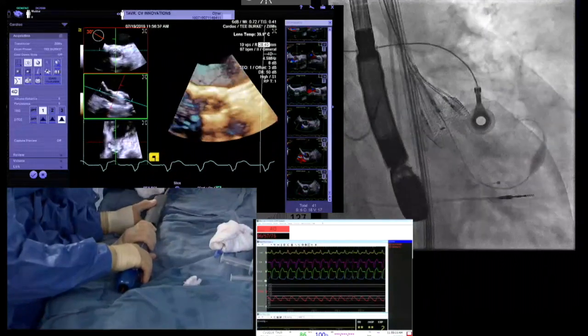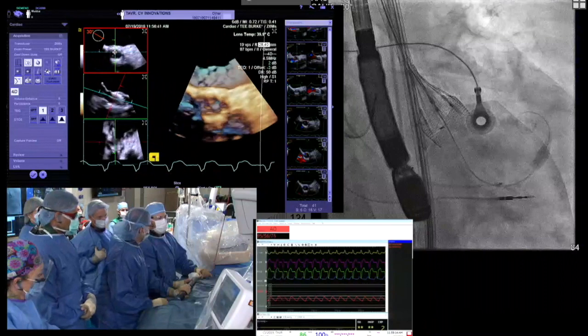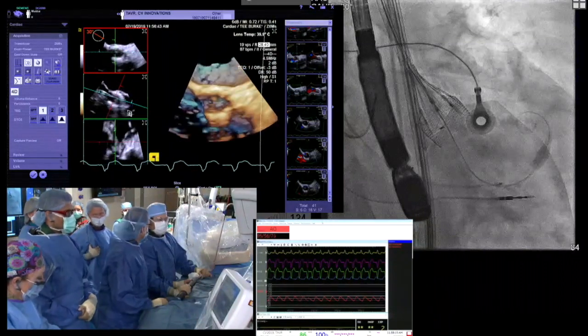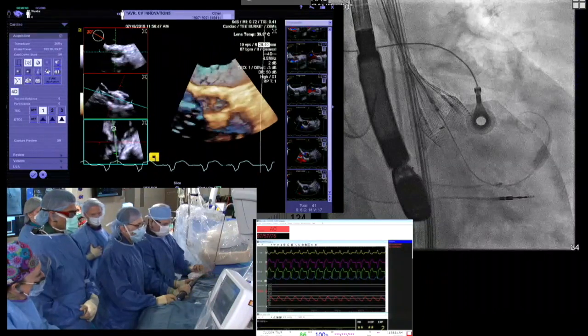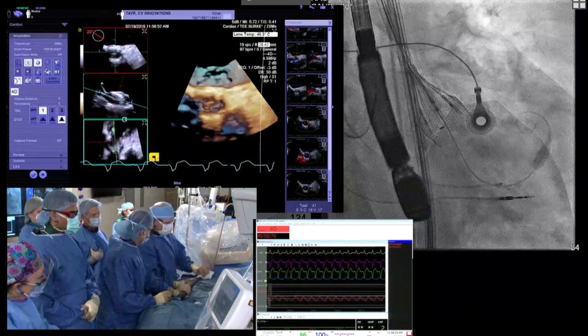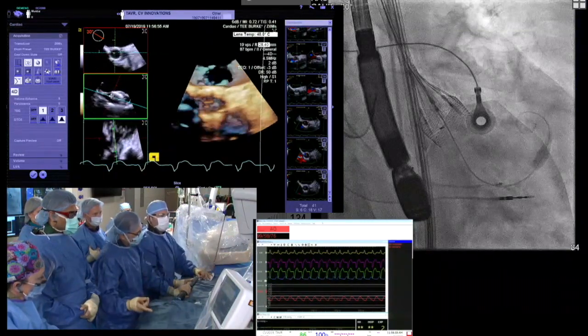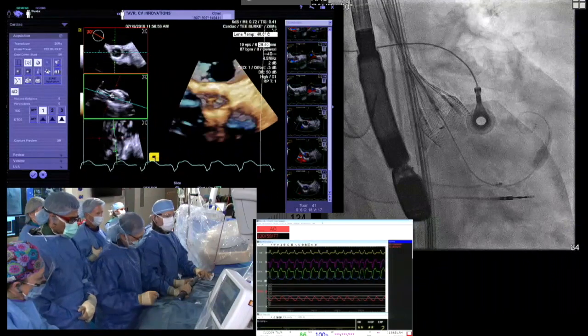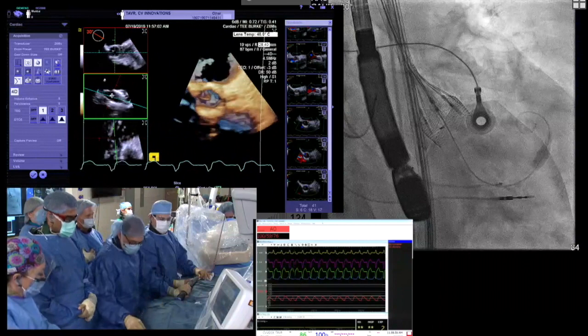So David, before you do that, at this stage, you did all of that. What if we didn't like it all of a sudden? Get a mulligan. We can do what now? We can fully recapture, partial recapture? We have to drag it out? What can we do? I think you have a number of options. I try not to fully recapture at this point. Bill, have you done full recaptures when you've gone to this, or just partial recaptures? No, we've done full. Would you mind doing a contrast study just to take a look?